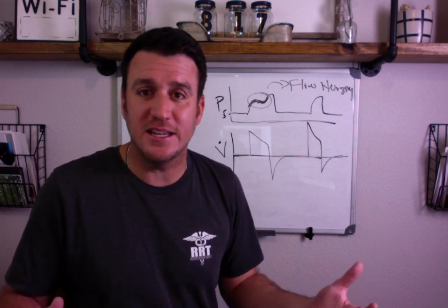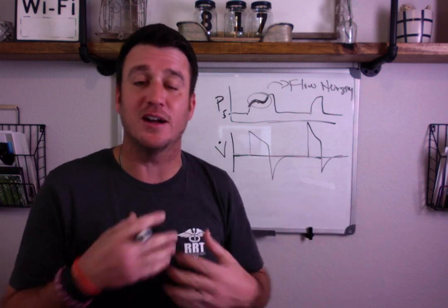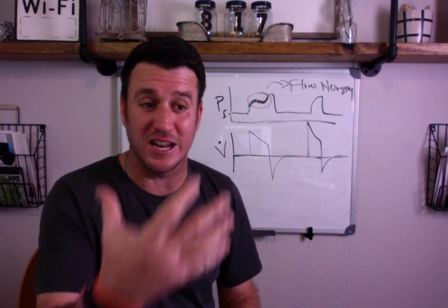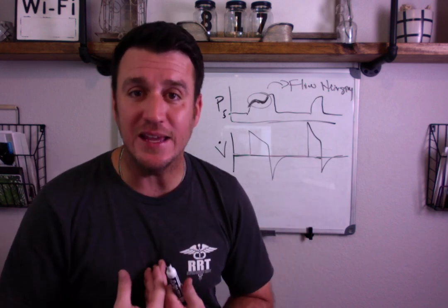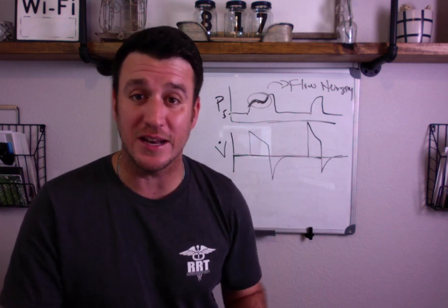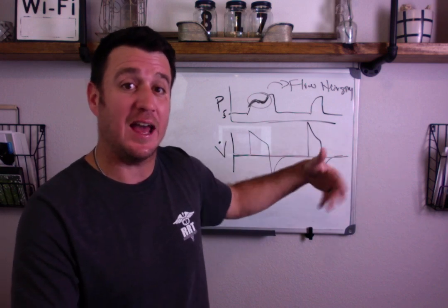We fixed their asynchrony. We made the ventilator breathe like they wanted, and they said, oh, thank you. I can finally rest and relax because the breaths that I'm receiving are fulfilling my needs. So thank you so much. So by the time we left, the patient was breathing 22 times a minute. We gave a report that night. We told him, don't panic, but the flow rate is set now at 135.